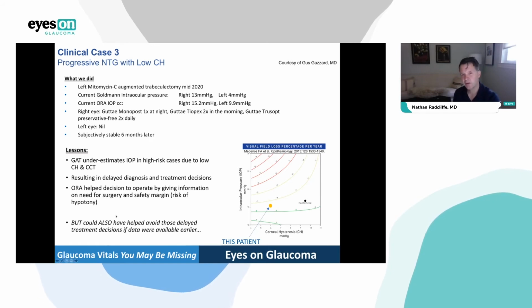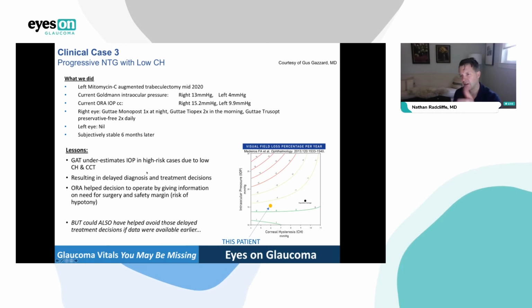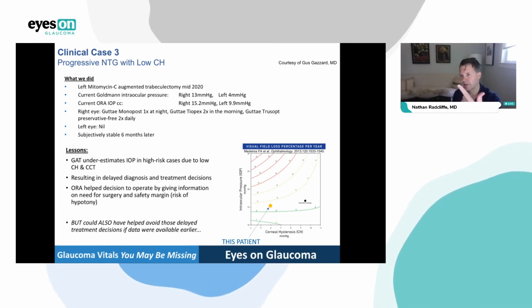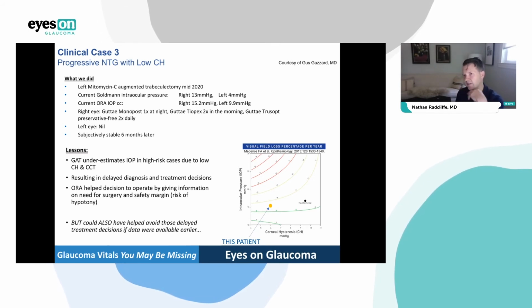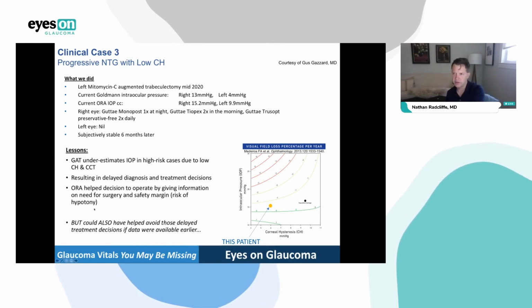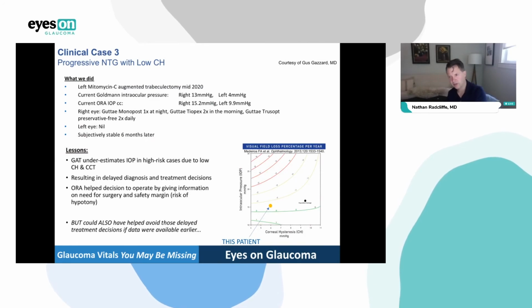But if I see someone with a really low hysteresis, the big decisions are, yes, I'm going to treat. No, a pressure of 22 isn't okay in someone with a hysteresis of 7, even if they have mild disease, or if they have more advanced disease, kind of just knowing you now need to really kind of go as hard as you can for those low teens. So it bolsters an argument for aggressive therapy, but just on the other side of the coin, I call the high hysteresis your get out of jail free card.